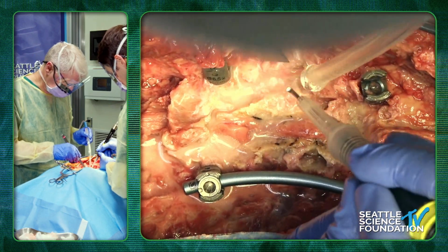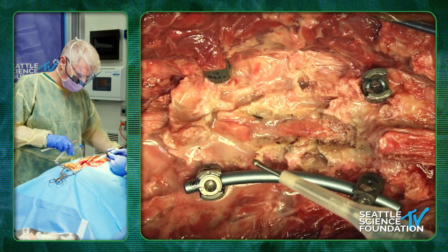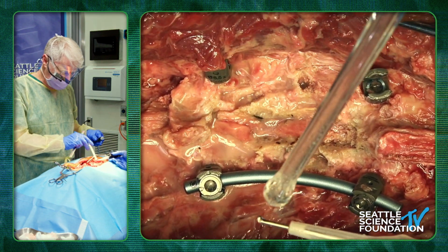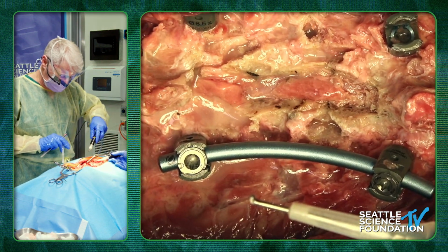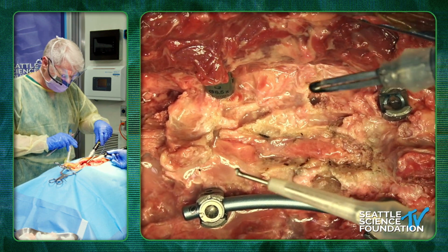Just let it cut. Okay. So perfect, yeah. So just show with the blade. So this is the Misonix. We have two types of blades here. This one is a straight cutter, and there's a 25-millimeter length, and we use it to cut through the lamina.